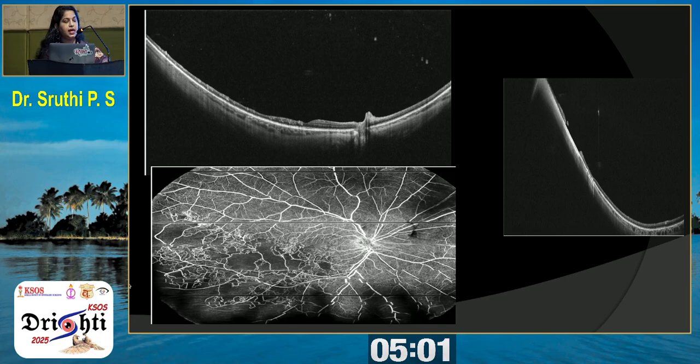This wide field OCT image helps to assess the peripheral retinal changes. For example, in retinal vein occlusion, in the left-sided picture you can see the retinal thinning temporal to the fovea, and similarly the OCTA image also shows the non-perfusion areas. In the right-hand picture, you can appreciate in the peripheral retina an operculated hole.